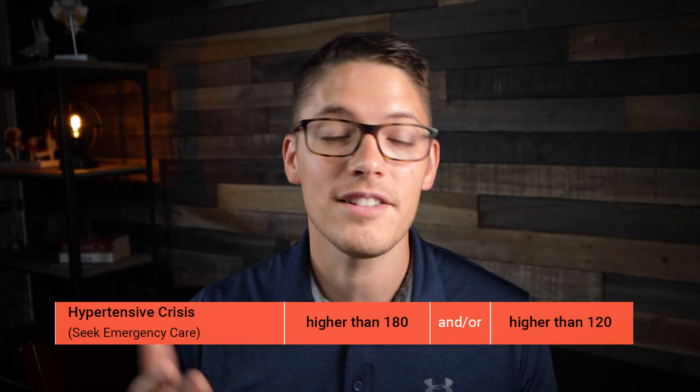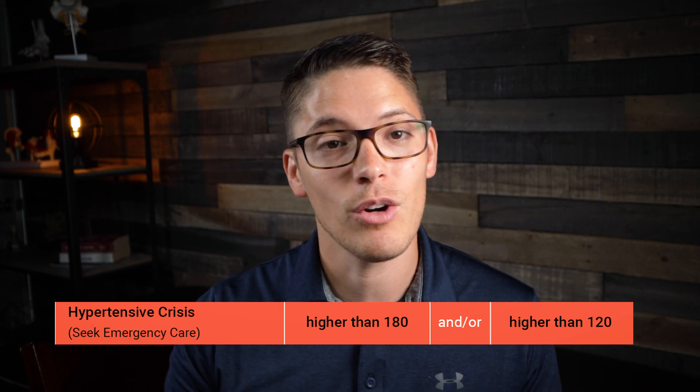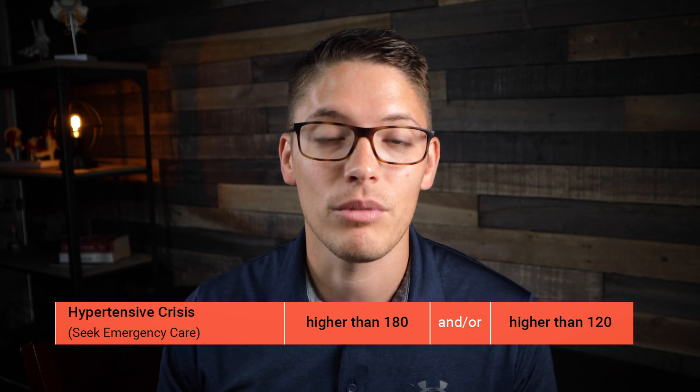Anything above 180 over 120 is considered a hypertensive crisis. If the device reads a number this high or higher, take your blood pressure again in a few minutes. If it continues to be this high, it's recommended that you contact your healthcare provider right away.